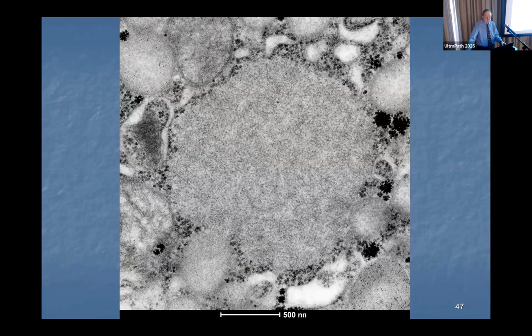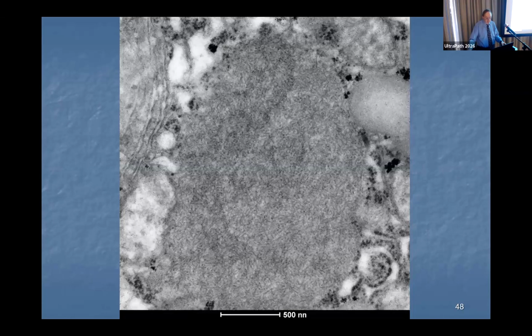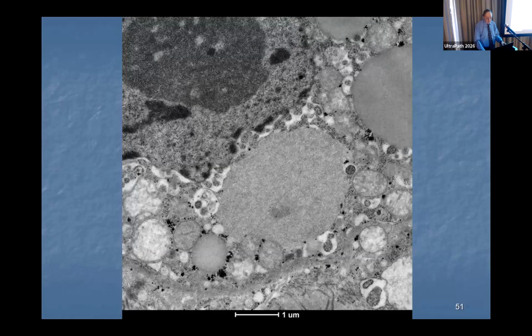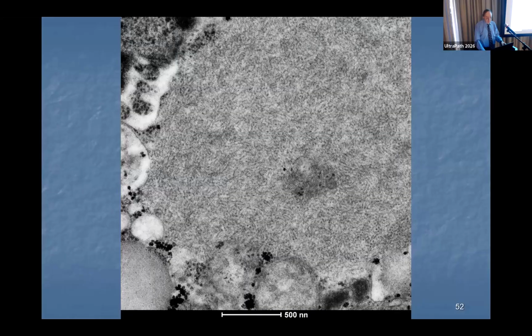You look at this at a little bit higher magnification, and you can start to see things that look more filamentous and perhaps even a little bit of beading to them. And these were not too difficult to find. We found these in many of the cells. And again, they have this filamentous to beaded appearance to them. And this is true with many different cells.